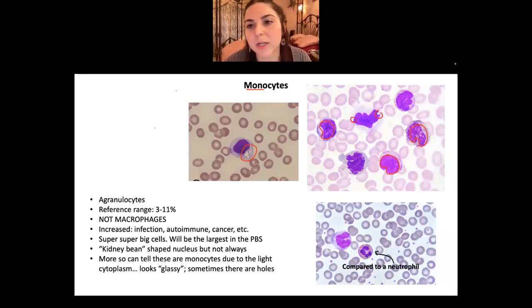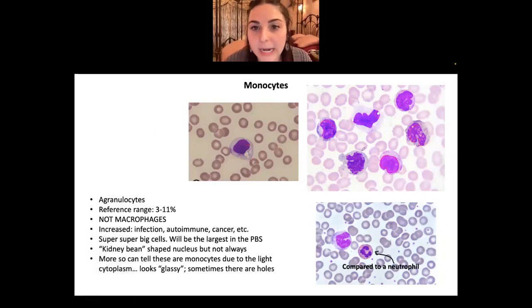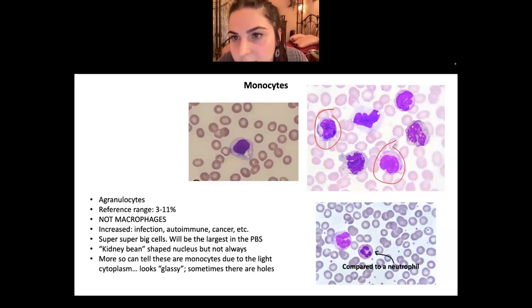And then just a trick for blood smears, if you're ever debating what type of cell it is. I've done tons of blood smears when I worked in a hematology lab. When you're debating what type of cell it is, we call it the company they keep. So if you see a bunch of monocytes and you're like, I have no idea what the cell is, it's probably a monocyte. They're in the company of a lot of other monocytes. Even if this looks completely different from the rest of them, it's still probably a monocyte because it's keeping the same company, if that makes sense.